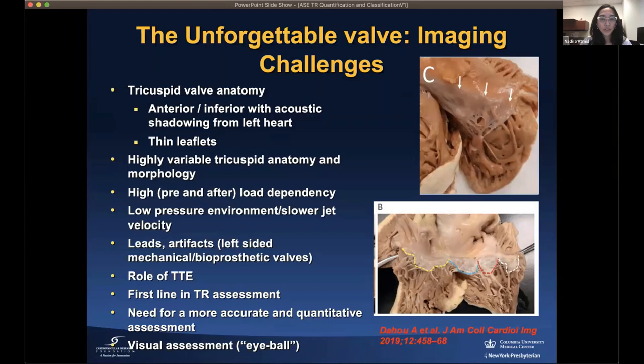The tricuspid valve is positioned anteriorly and inferiorly and can get acoustic shadowing from the left heart, particularly in the presence of artifacts such as left-sided mechanical or bioprosthetic valves. The tricuspid leaflets are thin, so it may be challenging to image them accurately. Over the last couple of years, transthoracic echo has proven crucial as a first-line tool in tricuspid regurgitation assessment, and we should move away from a purely visual or 'eyeball' assessment toward a more accurate and quantitative approach.